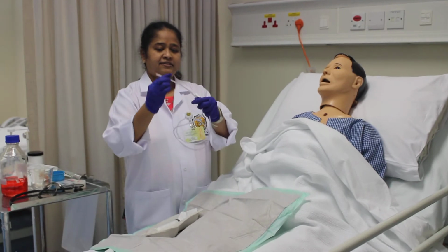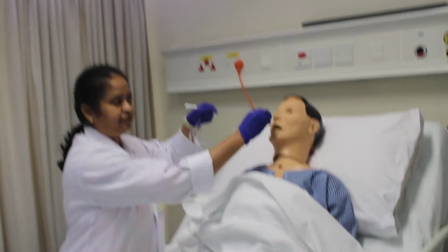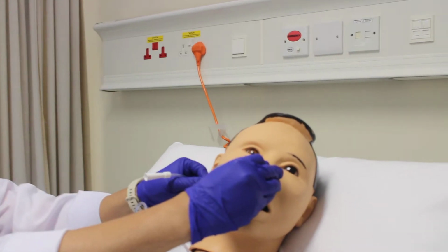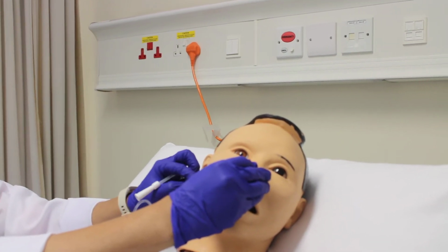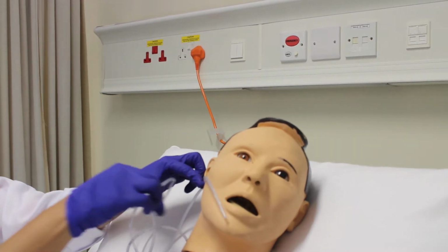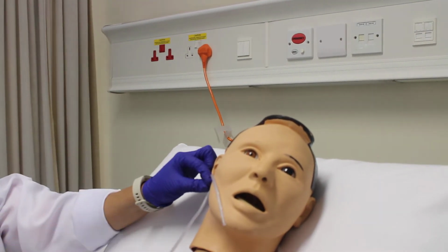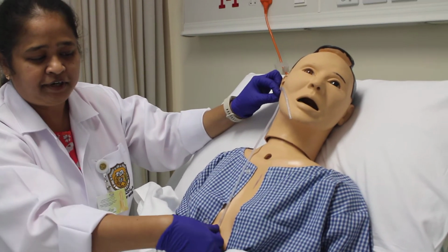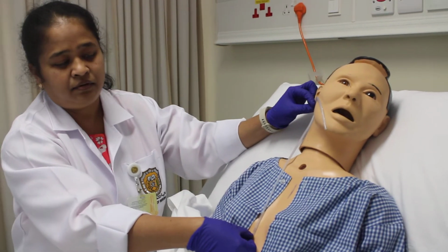Okay. This is the tip of the tube. The tip of the tube should be at the tip of the nose. Then you go up to the earlobe, the tip of the earlobe. Then with the same tube you come down to the xiphoid sternum. This is how we measure it.